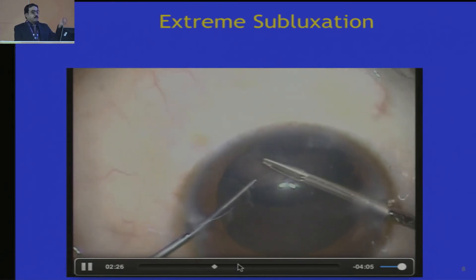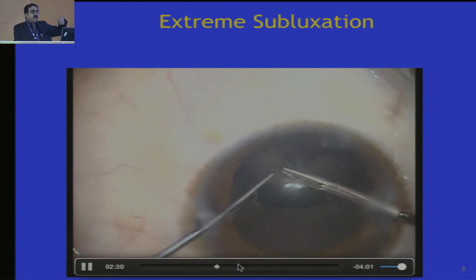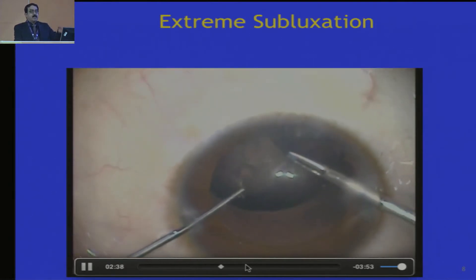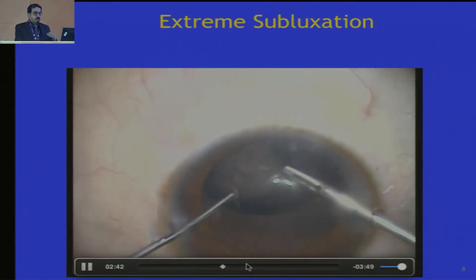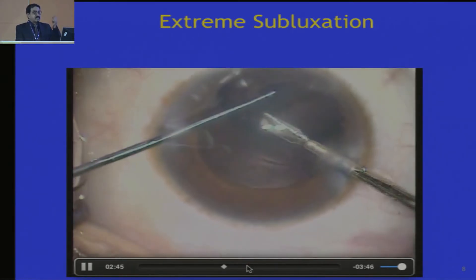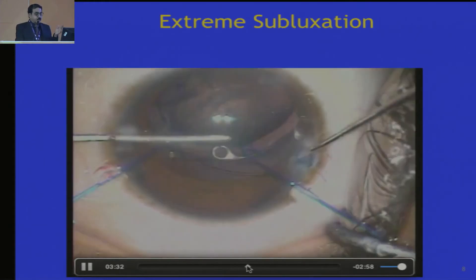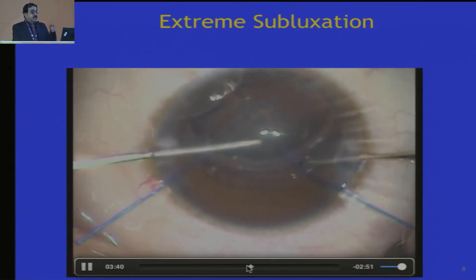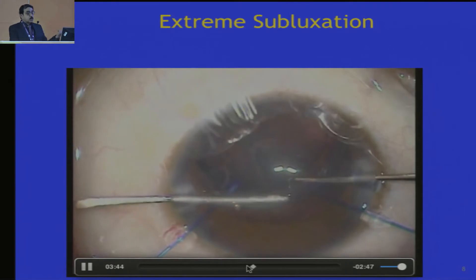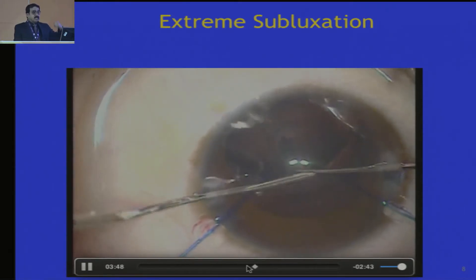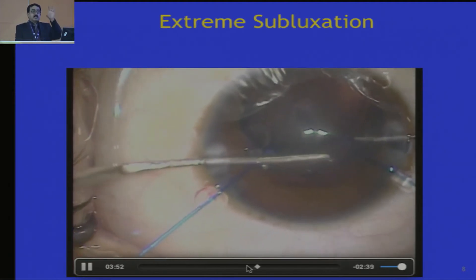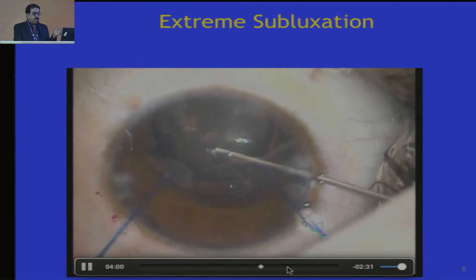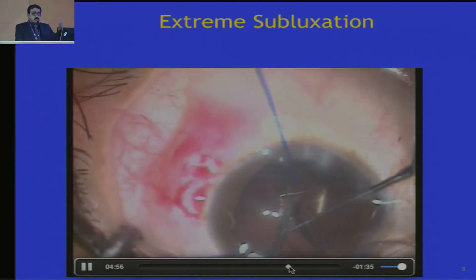This one is a little bit of a triumph. You have to support the rexis with the ball-tip dialer, and once you support it you are able to get through with the capsular rexis. It has to be a gentle procedure — please take time, please refill with viscoelastic, and you can actually get a good capsular rexis. Once a good capsular rexis is done in such a difficult case, most of the work is actually done. In this case, we are putting in the iris hooks — the iris hooks also support very well. Placing the CTR inside the bag is very important, and please remember that whatever zonules are present do help. Nothing is lost and you need to try. It is only when you have really damaged things that you abort the procedure — but try till the last.